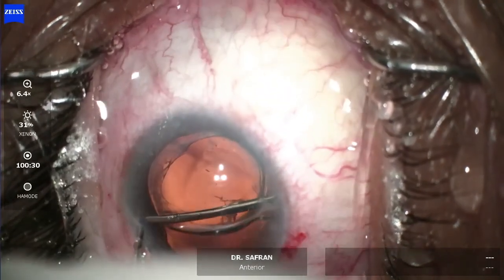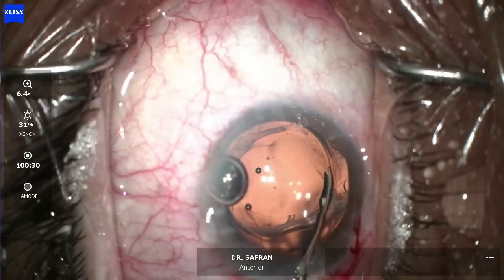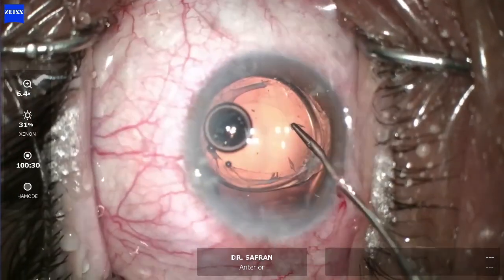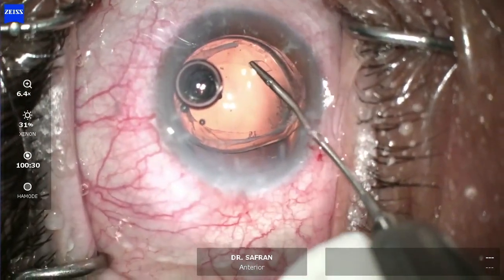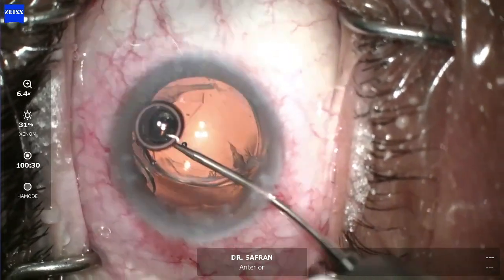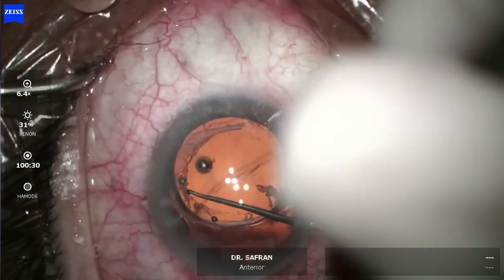Here we're attempting to reopen the bag, and the anterior capsule opening is small. I'm going to try to retear this a little bit by making a small cut in the anterior capsule and using a 25-gauge micro forceps to retear it and make it a bit larger.